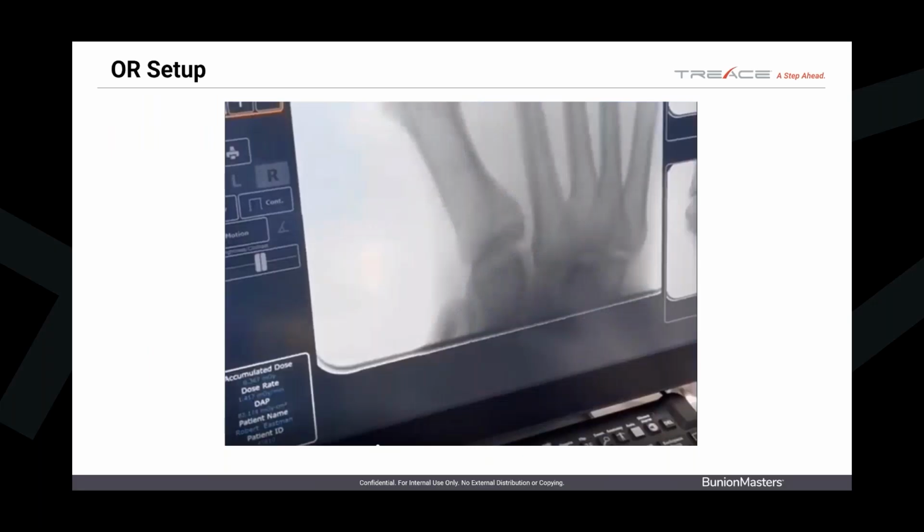If you want to bump it up to get it out of the way of the other foot, if you're leaving that straight, then go right ahead. Personally, I don't like the other foot in my way, so I bump it out with a knee holder, so I'm staring at only one foot, and I can have full access to that foot, both medially and laterally. So I sit during the surgery, and I'm a right-handed surgeon, so I always sit to the left of the patient, and I always work from the side. If you want to work from the front on the patient and put the jig on and work everything from the front like you do for normal surgery, then go ahead and put the fluoro to your right or left.